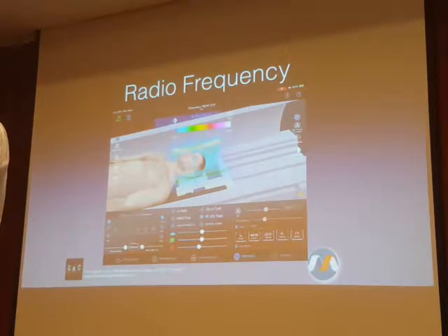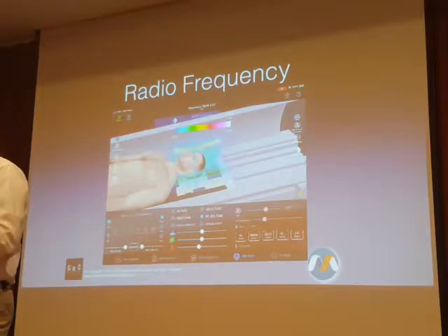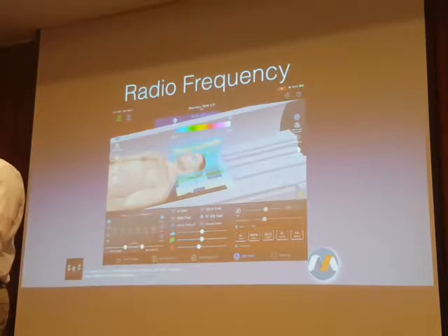Different manufacturers or different individual MR systems have different minimum thickness requirements. Some of the Siemens systems have a minimum thickness of 5 millimeters. Some of the GE and Philips systems have 7 millimeters. Some of the old GE systems have a 1 centimeter minimum. So there is system-specific thickness. Your MR system should have come with pads from the manufacturer that meet their minimum criteria.